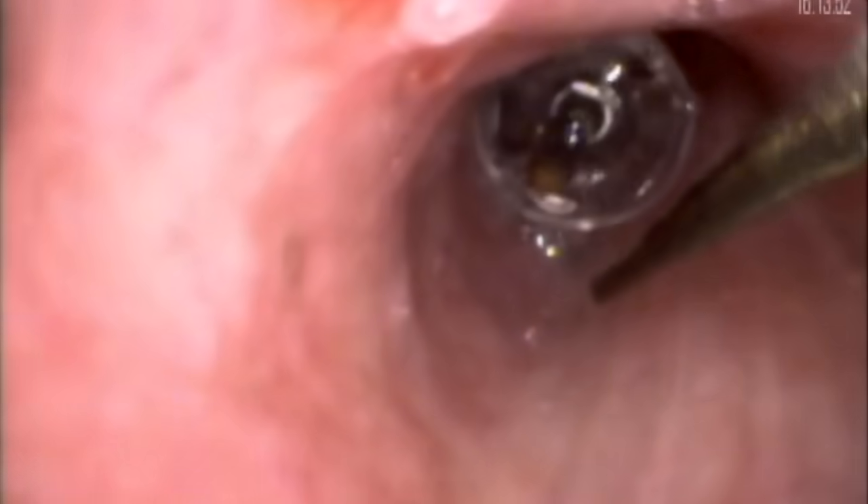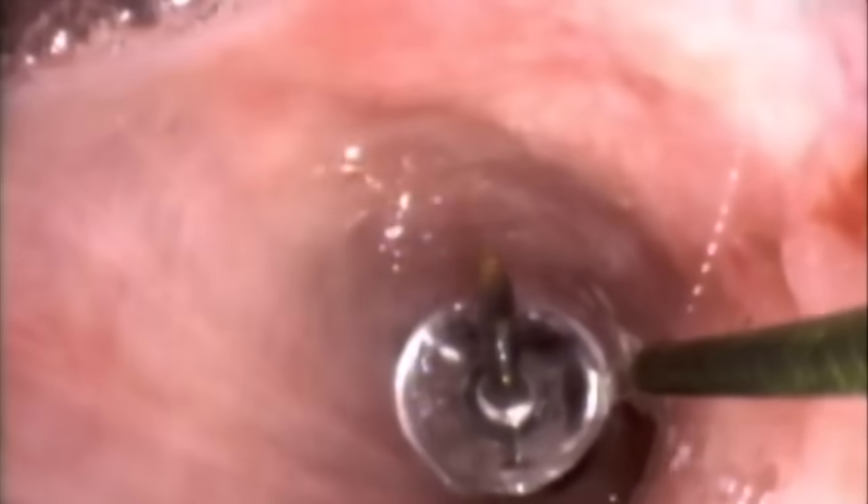Here is the pushpin in the right mainstem bronchus where we placed it. For our third and final attempt to remove the pushpin, we will again use the airway retrieval basket. We want the retrieval basket to pass the pushpin distally so that we can snare the plastic end of the pushpin with the retrieval basket. On this attempt, we were able to successfully advance the basket past the pushpin. We deployed the basket behind the pushpin and successfully snared the plastic part of the pin after a couple of attempts.